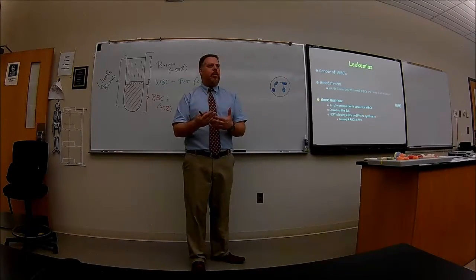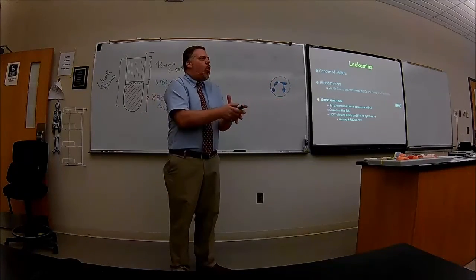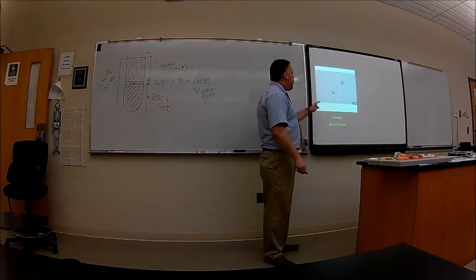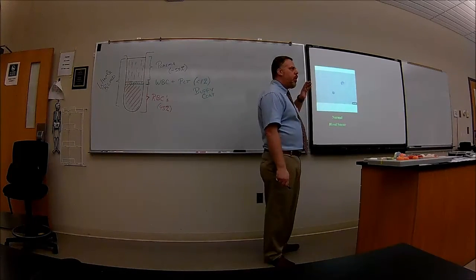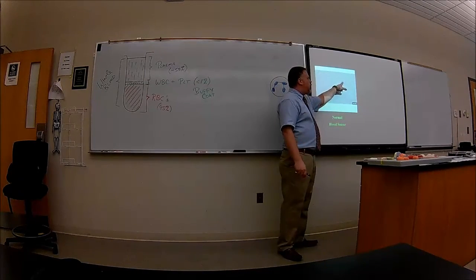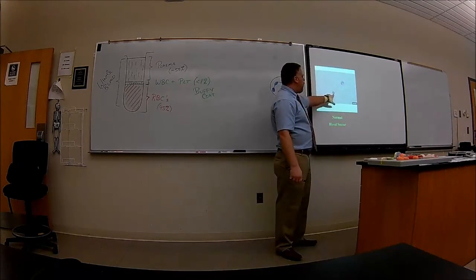There's nothing wrong with the platelets. There's nothing wrong with the red blood cells. There's just not enough of them because the white blood cells are overcrowding the bone marrow, since there's just too much of it. Okay? So that's what happens. This is what a normal field of view would look like. You might see one, two, three, maybe four white blood cells in one field of view. What type of white blood cell is that?